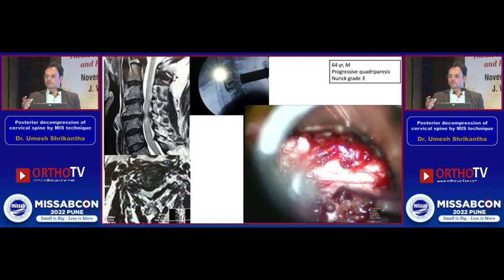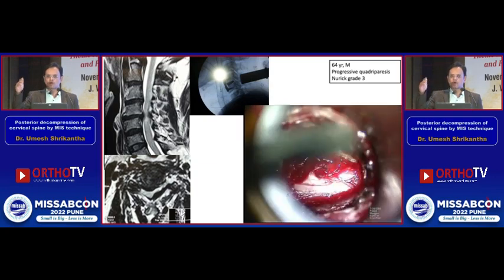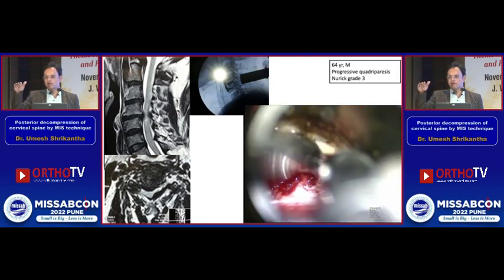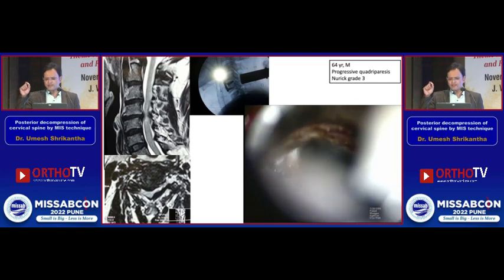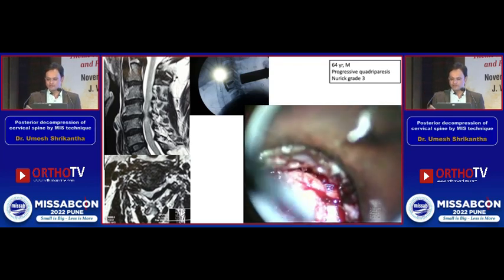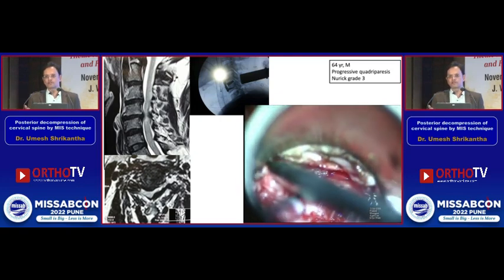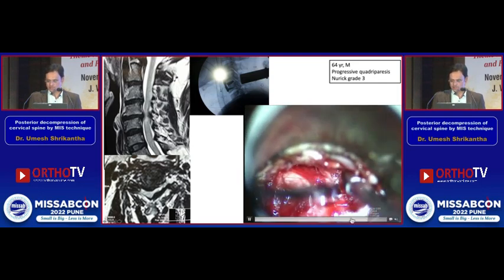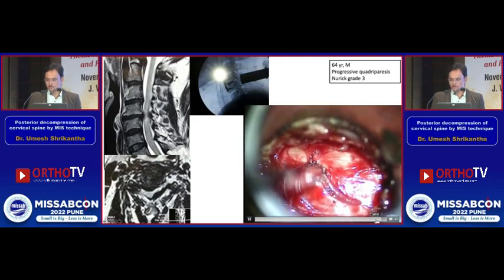And just like what we do in the lumbar spine, we tilt the tube to the contralateral side for the contralateral sublaminar decompression. The inner cortex of the contralateral lamina can be drilled just like we do in a lumbar spine with a 1.7 millimeter burr. And then we can remove the ligamentum flavum. We can free the ligamentum flavum from its attachment, and we can remove it using either a hook or a forceps, or sometimes we can even use a 1 millimeter upcut in order to remove the ligamentum from the contralateral side, and that will result in a good enough decompression of the cervical spinal cord.